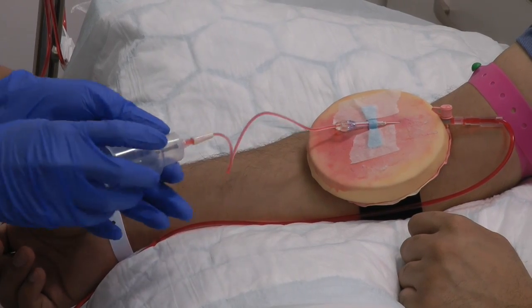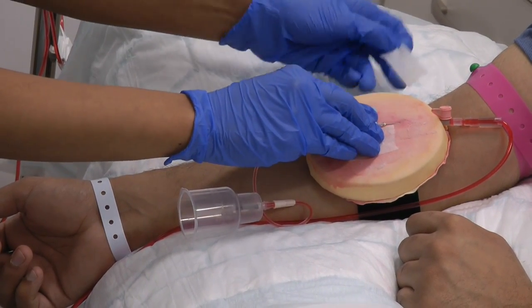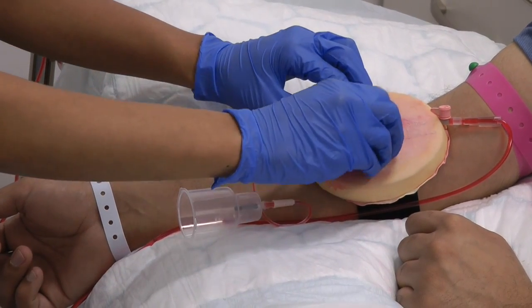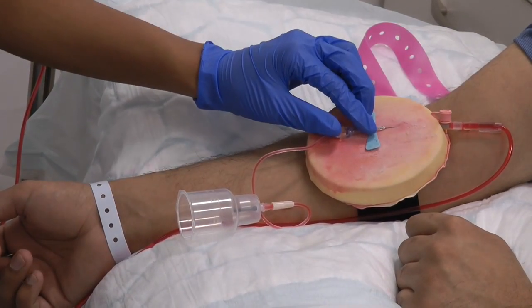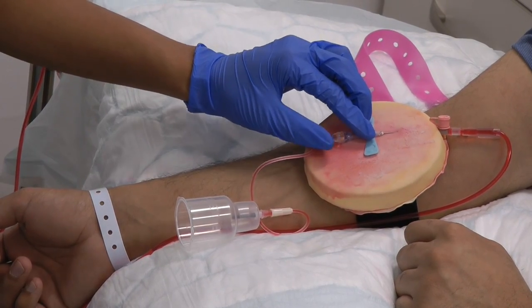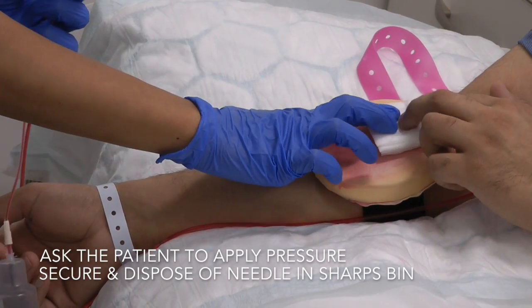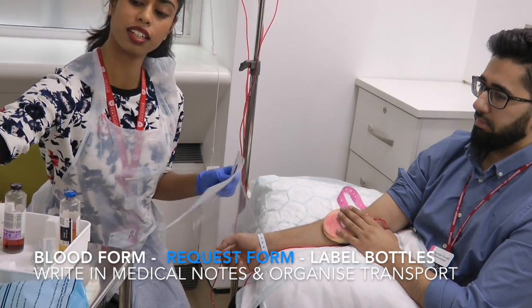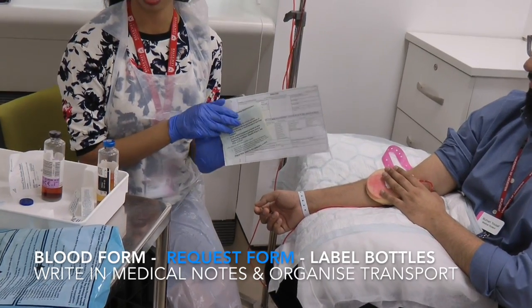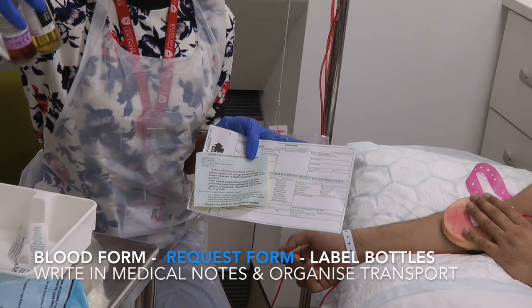Now I'm going to remove the wings. Release the tourniquet. I'll take the needle out. Do you mind applying pressure? Sure, thank you. I would fill out all the details on the blood form, complete the blood request form, write in the medical notes, as well as arrange for transport of the blood samples, which I will correctly label with the patient's details.